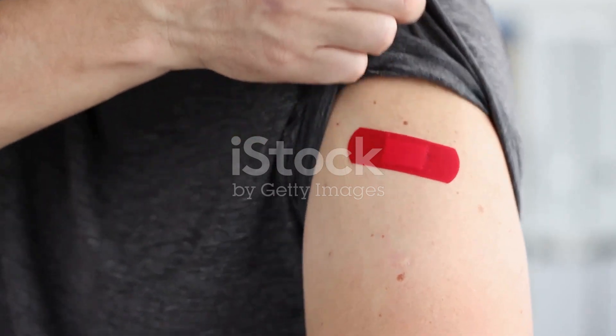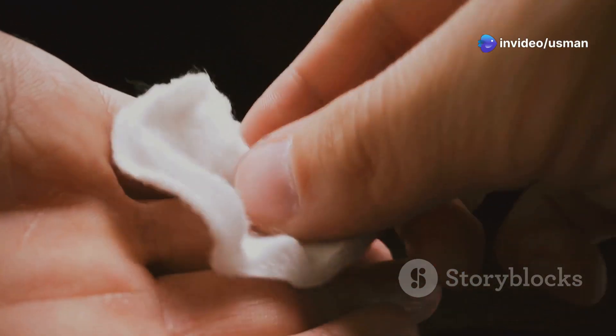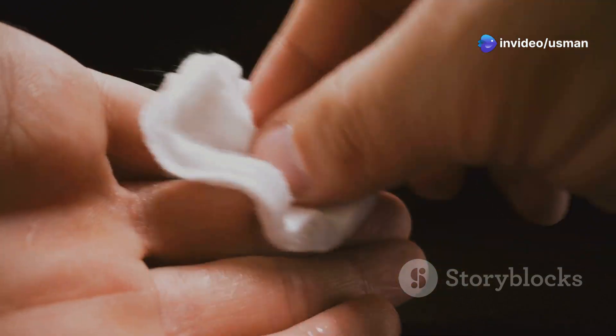First, wash your hands thoroughly with soap and water. Next, locate the injection site on your body. Common sites include the upper arm, thigh, and buttock. Clean the injection site with an alcohol prep pad and let it air dry.